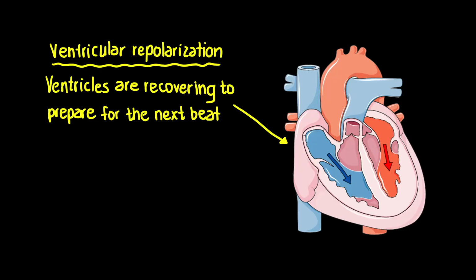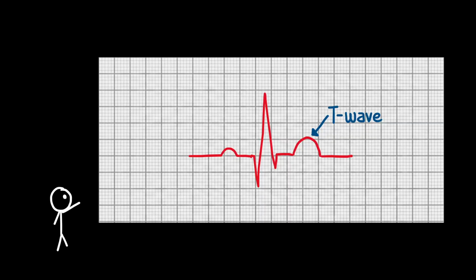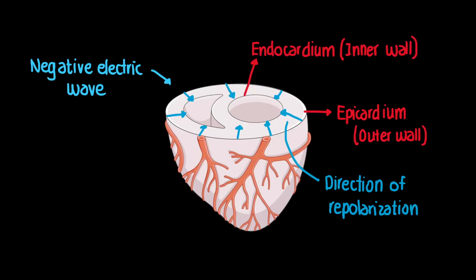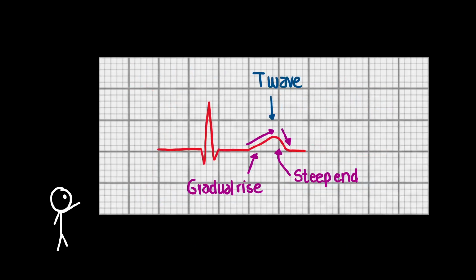The T wave represents ventricular repolarization. It reflects the recovery phase of the ventricles after depolarization. It is normally upright in most leads because ventricular repolarization occurs in the opposite direction to ventricular depolarization. Its morphology and direction help determine whether repolarization is occurring normally, and its symmetry can reveal important abnormalities in the repolarization process.